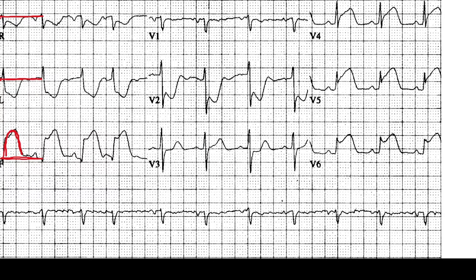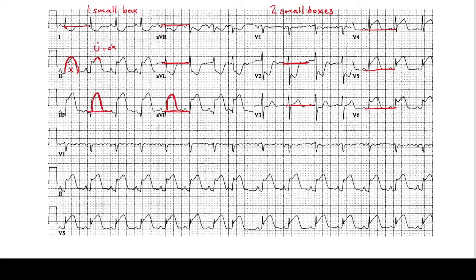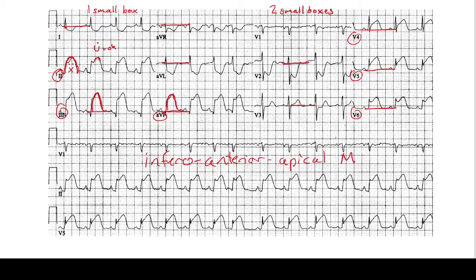In V2 we see significant ST depressions. In V3 there are no Q waves, no peak T waves, and maybe some slight ST elevation, but drawing a line shows it doesn't meet the two-box criteria. However, in V4, V5, and V6, all of them do have ST elevations. So this patient has ST depressions in 1 and AVL, ST elevations in 2, 3, and AVF — the inferior leads — and ST elevations in V4, V5, V6 — the anterior and apical leads. This is an inferior anterior apical infarct with reciprocal changes in 1 and AVL, the lateral leads, and the septal leads.